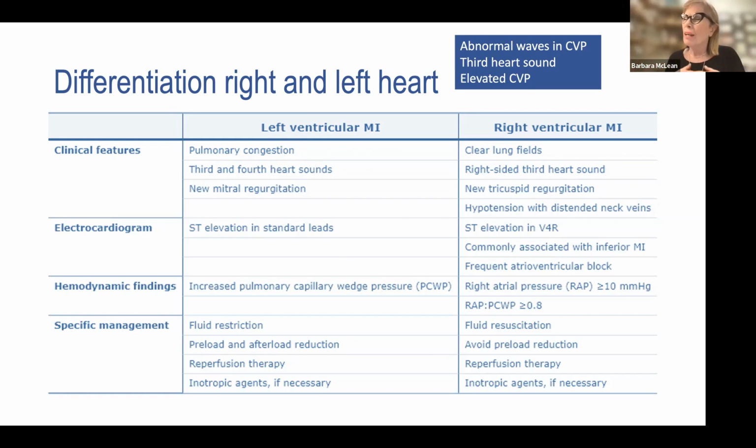And again, it requires a lot of expertise. You have to listen to 1 million hearts. 10 cardiologists listening to the same heart are going to have 10 different definitions. So it's not quite as valid or valuable to us as actually being able to look at the waveforms in our CVP analysis and make good decisions as they relate to that.